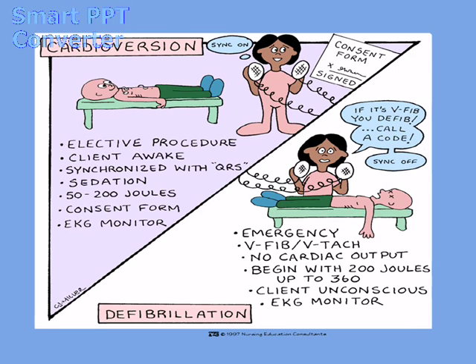As with defibrillation, in cardioversion we need to make sure that all staff, all bystanders, are clear of the patient, the equipment connected to the patient, and the bed when the shock is delivered, because we don't want to inadvertently shock the respiratory therapist that's standing there. So we all do that. I'm clear, all clear, we're all clear. You're clear, I'm clear, you're all clear, however the mnemonic goes. But we want to make sure that they're standing clear.